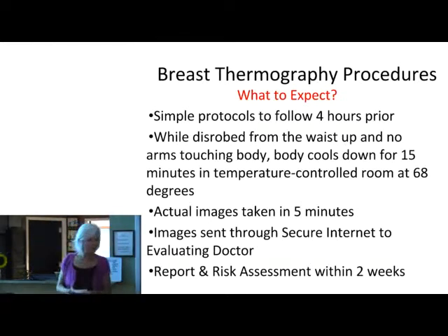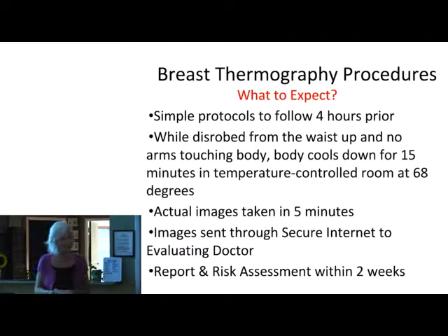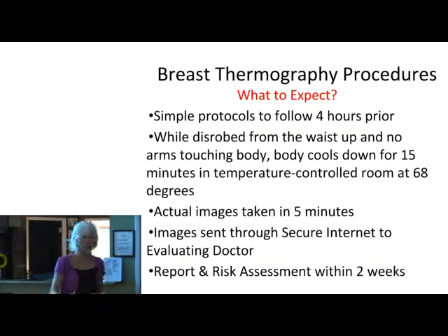Simple protocols. I have a protocol sheet that I send out to every client when they make an appointment with me. And what I want you to do prior to coming in is simply cool your body down. You're going to be further cooled in a temperature-controlled room around 68 degrees, undressed from the waist up for about 15 minutes. But prior to coming, no caffeine, no heavy exercise, no chiropractic care, no lotions, no antiperspirants or deodorants before you come, because all of these things heat the body.